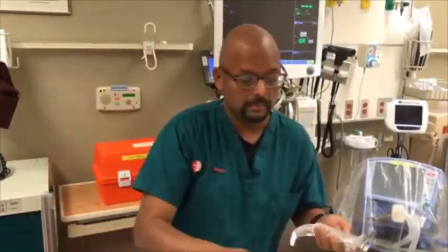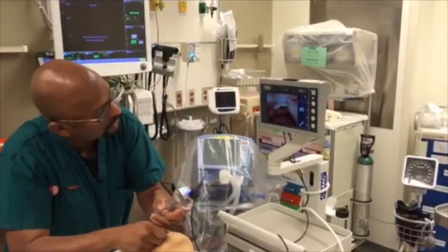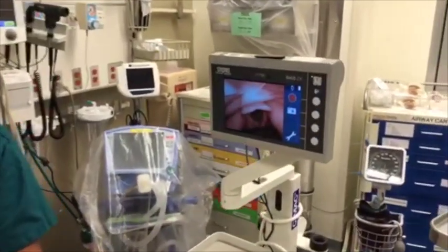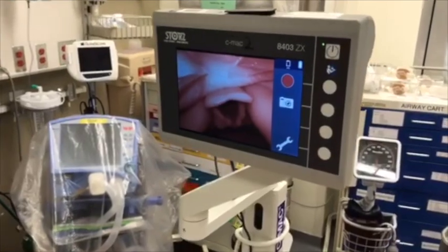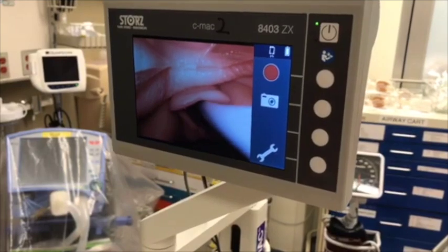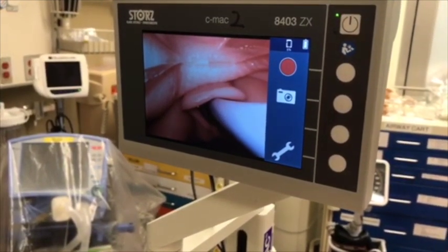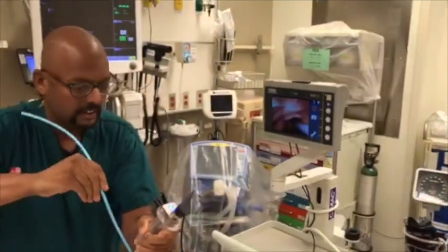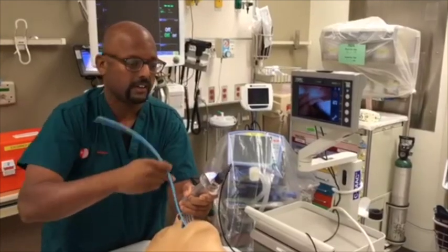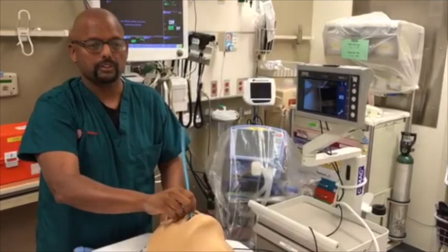So let's see what that looks like on the mannequin. As the bougie comes in, this is where I find I get hung up much of the time, so I'm going to use this drawing circles technique to turn the bougie — and I find the obstruction cleared. The bougie advances and we can put the tube across.